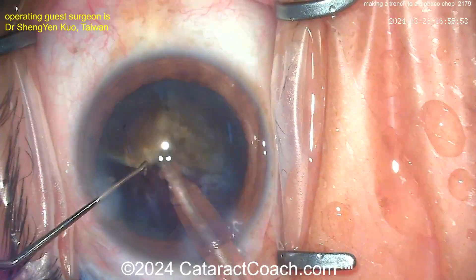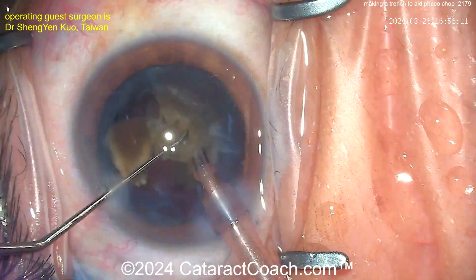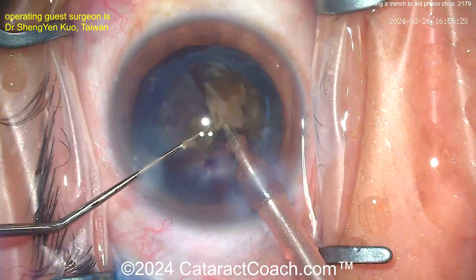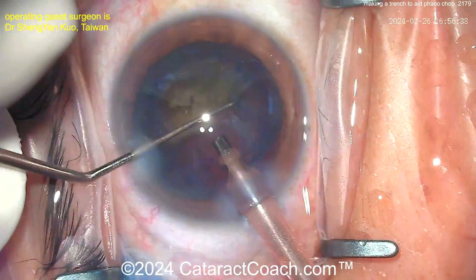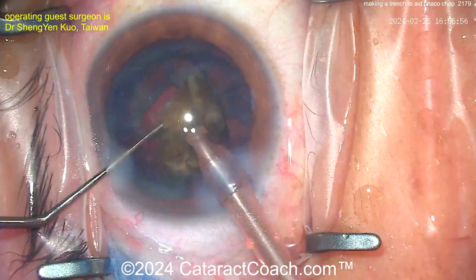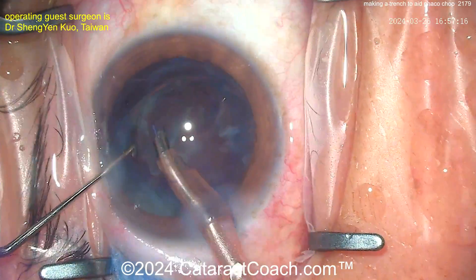This is the trench chop. There are very similar variations — the pit chop technique, the submarine chop that we learned from Mahanta — all kinds of great techniques. The bottom line is the same: you're going to use more mechanical forces to separate and chop the nucleus into pieces, physically trapping the nucleus between two instruments to exert more pressure instead of just relying on phaco vacuum holding power.